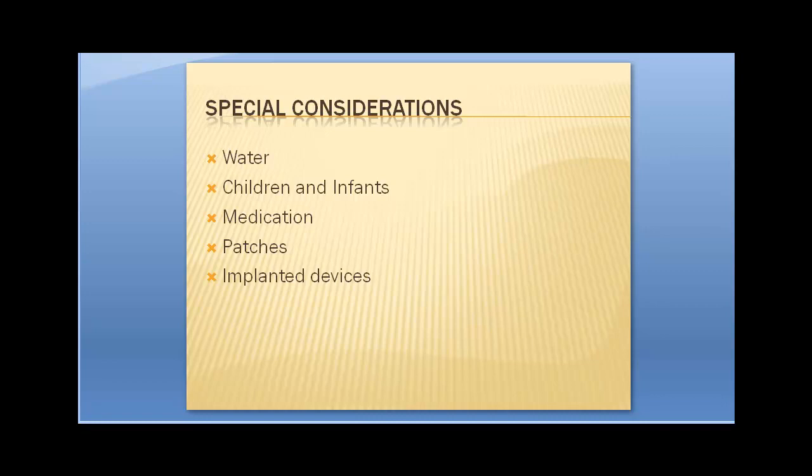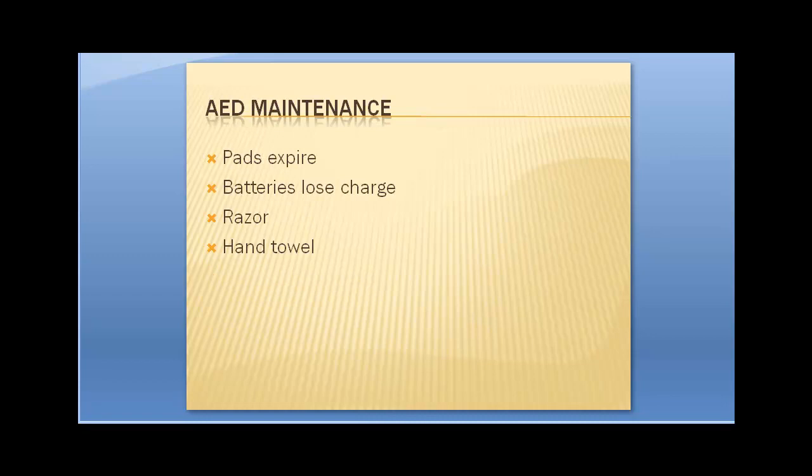And you can have people take blankets or jackets and get near somebody. I mean, they're unconscious, unresponsive, they're having a heart attack. I don't think they're going to be embarrassed about people seeing their exposed body. And you're just exposing the upper body.